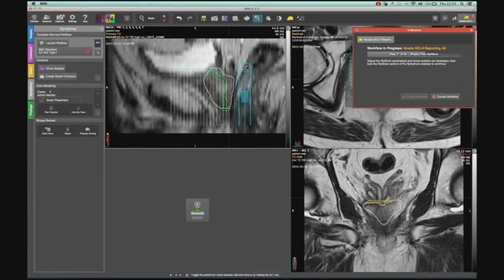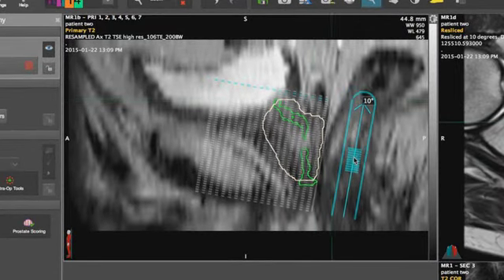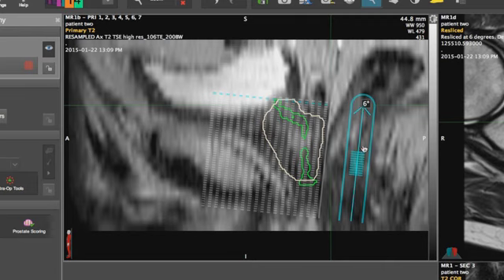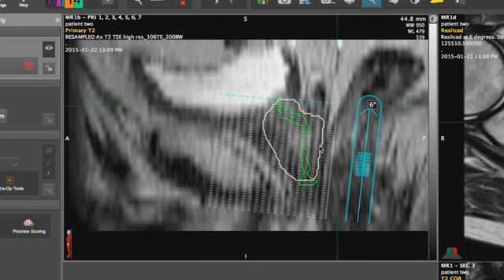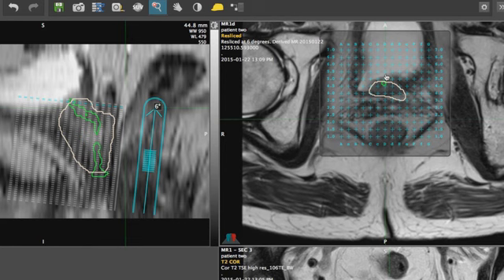What MIM allows you to do is it allows you to reslice the prostate, giving you the plane of the ultrasound. And you do that by using this virtual transrectal probe. We place the probe so that the line of the posterior capsule is parallel to the transrectal probe, and that's when you're in theatre, you try and align the transrectal probe to the posterior capsule of the prostate.